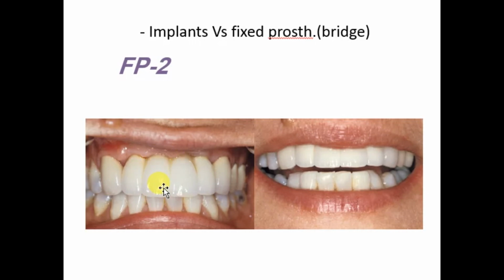The soft tissue drape is also reduced around prosthesis. The high maxillary lip line during smiling is noted before fabrication of the prosthesis. When the upper lip during smile does not expose any of the interdental papillary regions, an FP2 prosthesis may be fabricated.